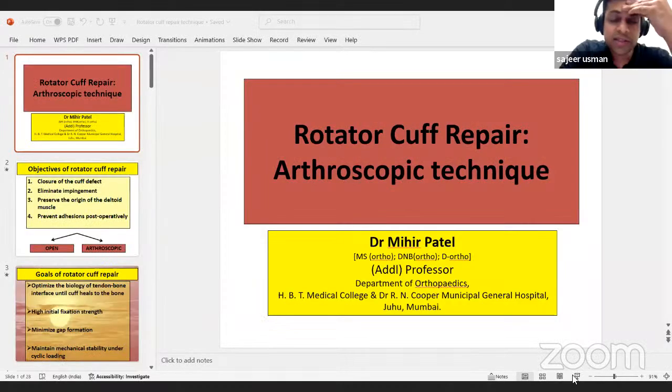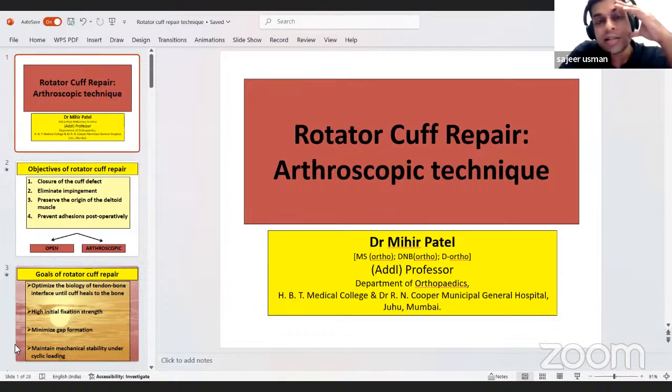Yes, done. No, the most important point that Abhishek shared, which is very valid, is this: knots on the superior labrum repair always create a lot of irritation and inflammation. These patients have throwing pain before surgery, they have throwing pain after surgery, so they are confused whether it's the repair or the knots. They end up needing some shots just to reduce the inflammation, and eventually they do get results, but knotless anchors are probably my way forward, if at all we consider a SLAP repair, an isolated SLAP repair.